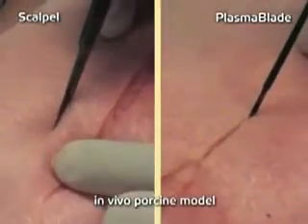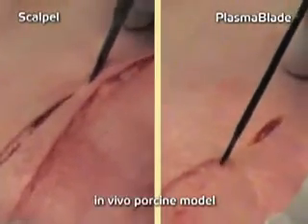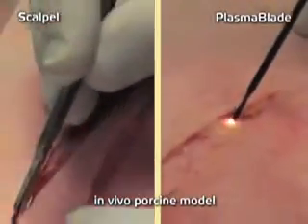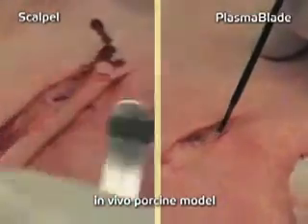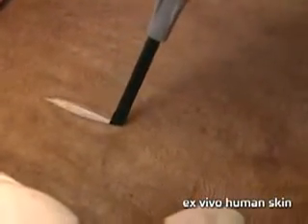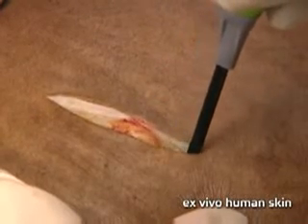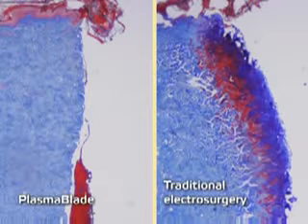The Peak Plasma Blade provides the best of both worlds in a single tool. It reduces bleeding by 60% compared with a scalpel and generates half the heat of traditional electrosurgical devices. The Peak Plasma Blade provides surgeons with greater control, resulting in significantly reduced amounts of damage to surrounding tissue. This preserves healthy tissue, and in a preclinical study revealed improved surgical incision wound healing compared to traditional electrosurgery.